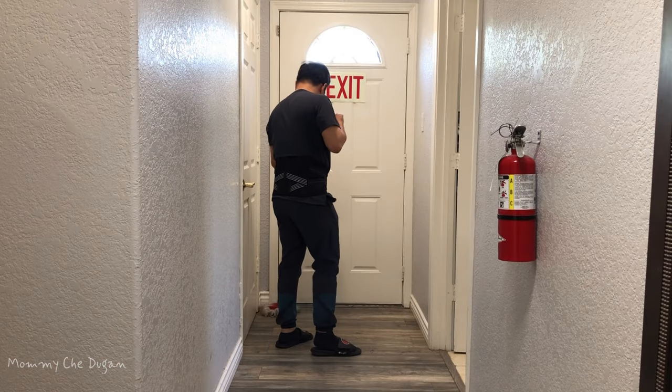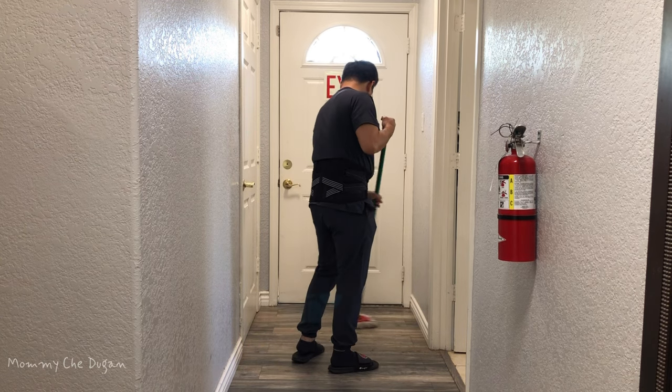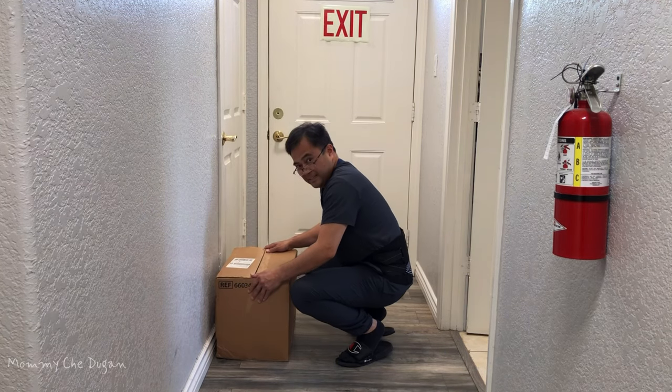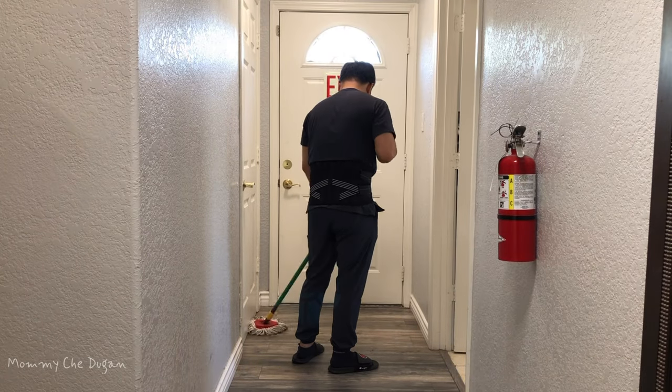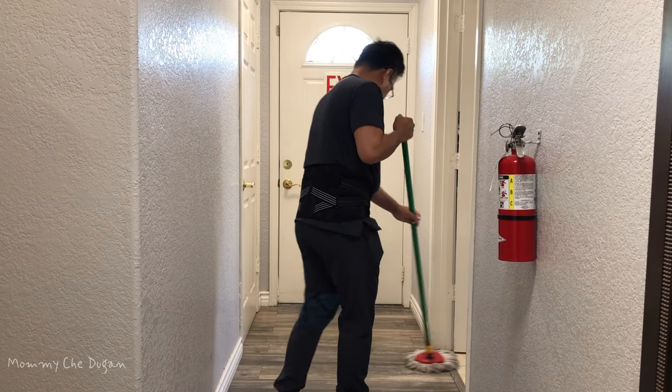This back brace is suitable for men and women and great for everyday activities such as lifting heavy objects, bending, sitting, standing, or walking for a long period of time. This is the back brace for lower back pain for men and women.